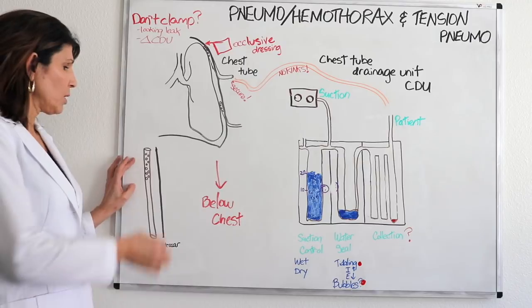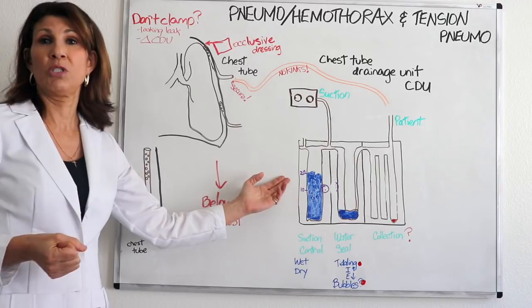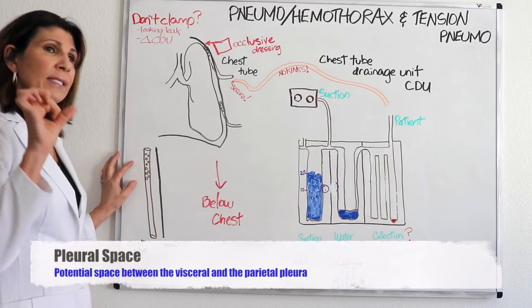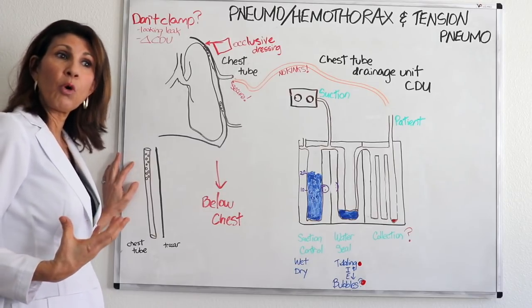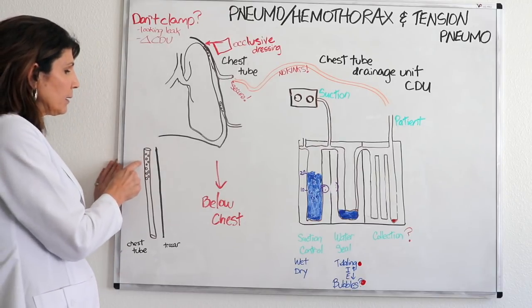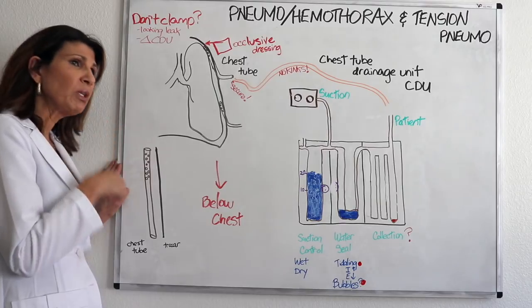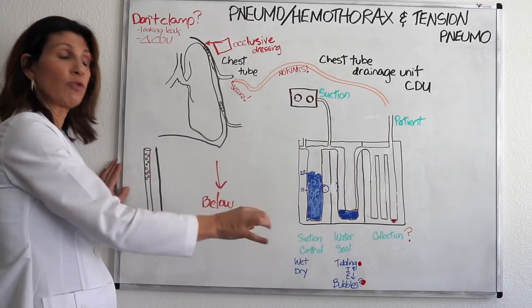It's just a tube. So most of the time when you think of a chest tube, what you're thinking in your mind is the actual chest tube drainage unit. The actual chest tube that gets inserted into the pleural space is about this big, and it has different sizes depending on how big the pneumothorax is and what you're trying to drain from the pleural space. And it's got little holes in it. Those little holes allow either air to escape or the fluid, whether it be pleural effusion or blood from a hemothorax, to escape through and dump into the chest tube drainage unit.